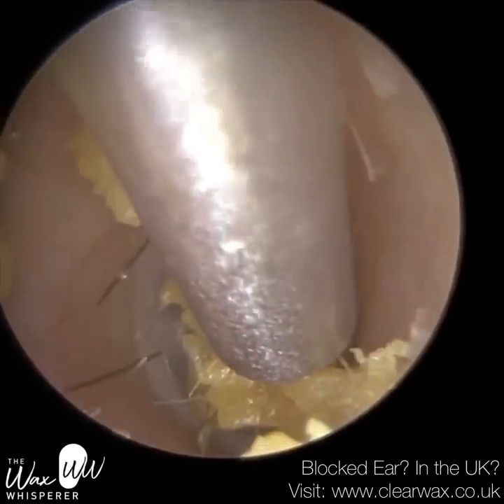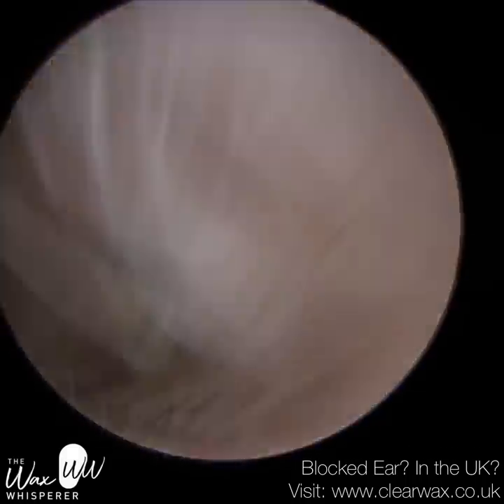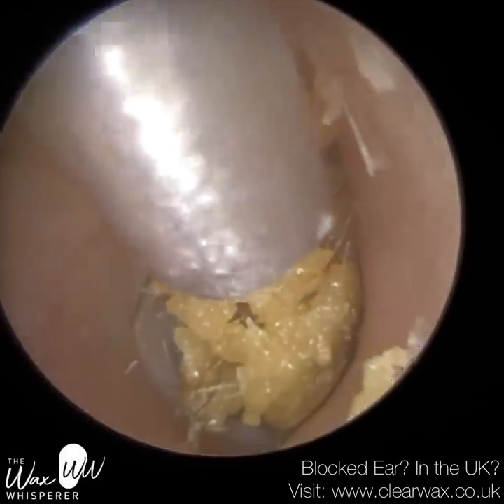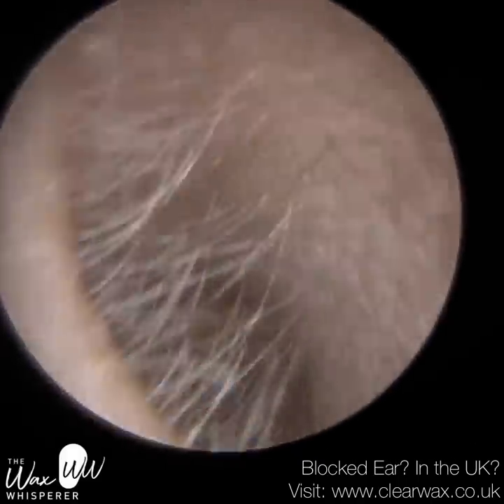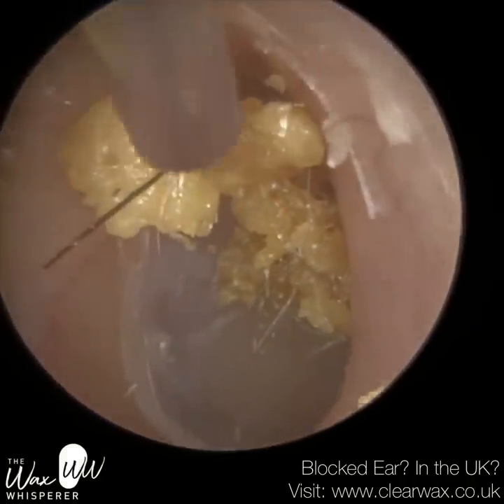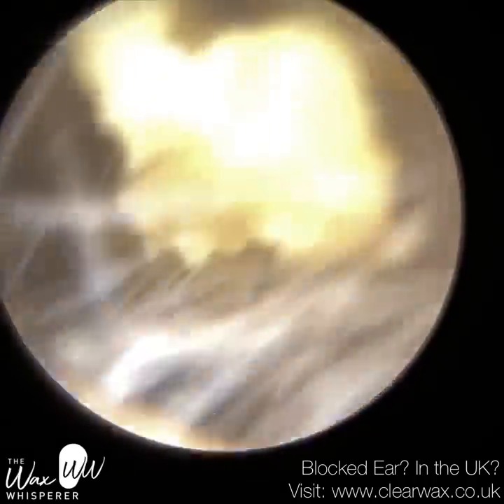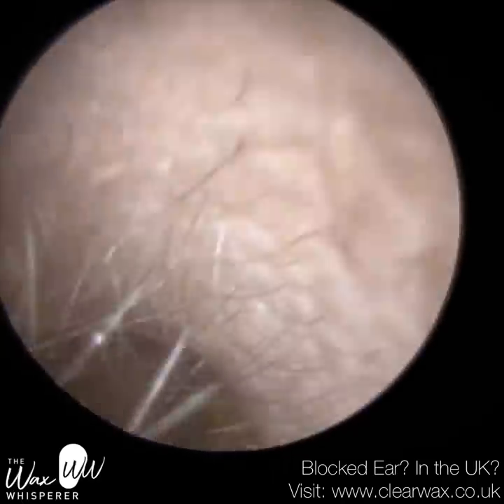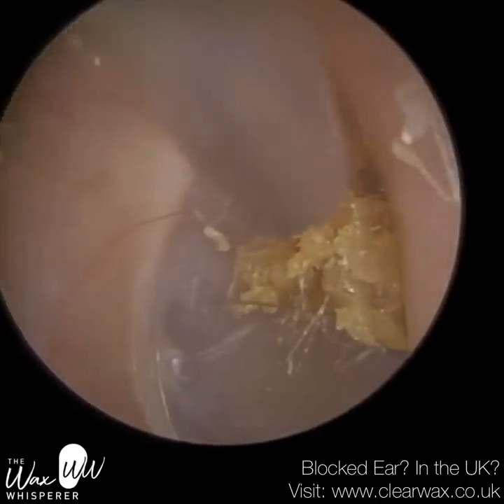This is patient one, and this is their right ear. This right ear was fine after the removal of the wax — there was no underlying pathology. But in their left ear, unbeknown to them, they had a posterior perforation. I really want you to stay tuned to see this perforation, because we can actually peer through it into the middle ear and see their incus, their stapes — the second and third of the middle ear bones — and also the stapedial tendon.